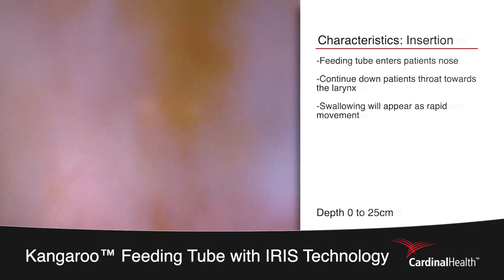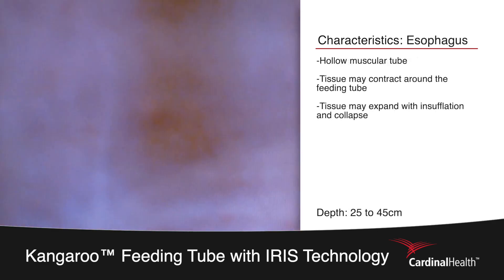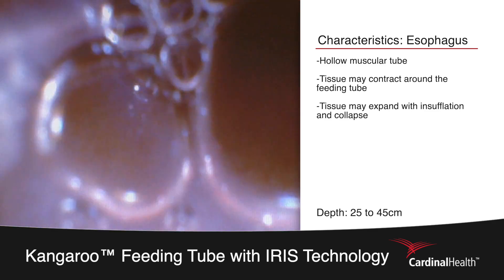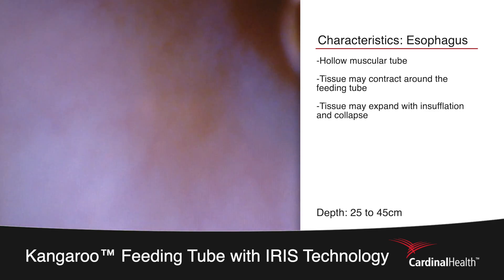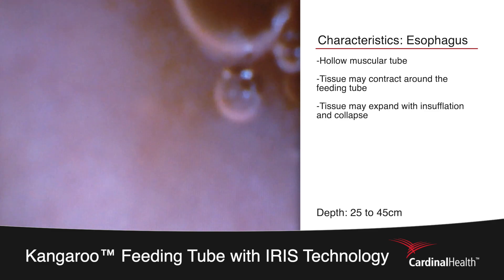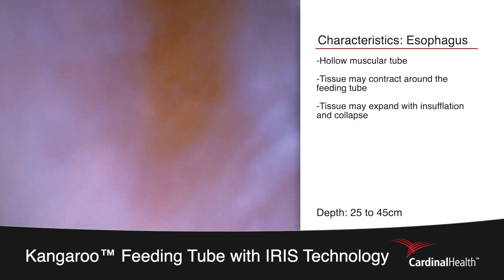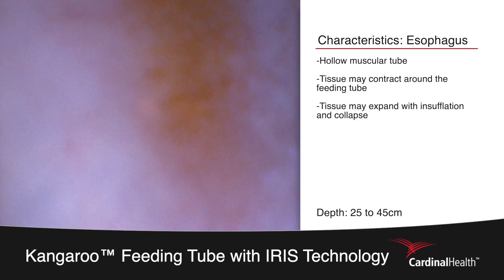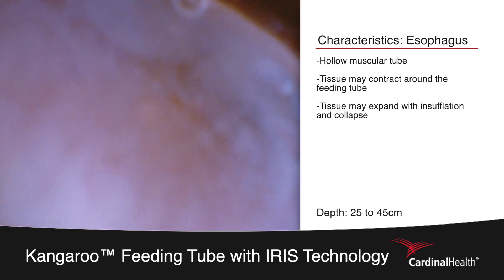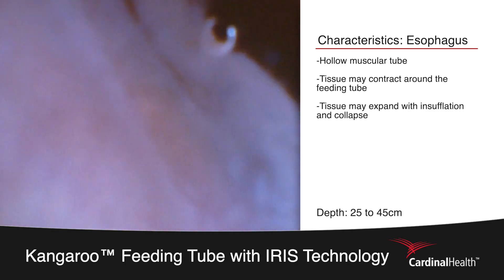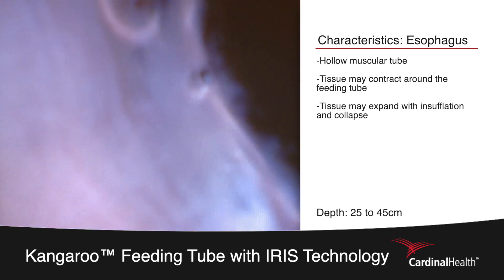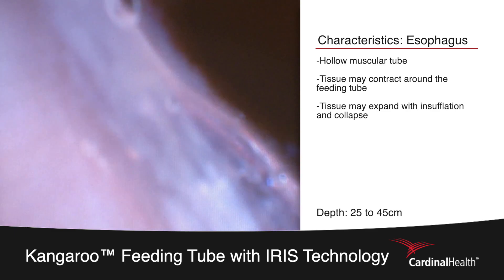At around the 30 centimeter mark we will pause to determine that we are in the correct location. The esophagus is a long, hollow, muscular organ that collapses on itself. You will be looking for the tissue of the esophagus to contract around the tip of the feeding tube. You can use the insufflation bulb to add air and create space, as can be seen in the dark image on the right of the screen.